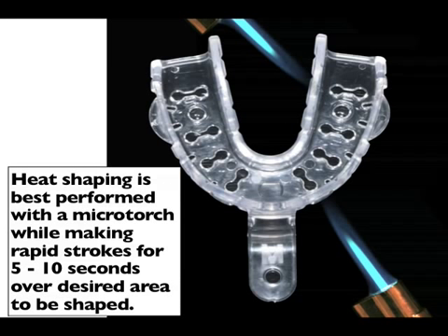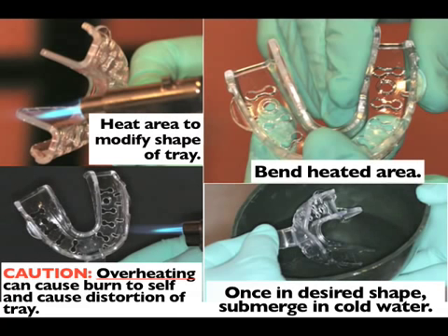Now in this particular case, we had to heat shape the tray, and we just took a micro torch and with very rapid strokes, about 5 to 10 seconds, you heat the particular area you want to reshape. What I'm showing here is reshaping both the posterior segment and the lingual segment. After any heat shaping, you must now place the tray in a bowl of cold water to re-solidify it. Make sure you don't go back into the patient's mouth until you're assured that the tray is cooled down.